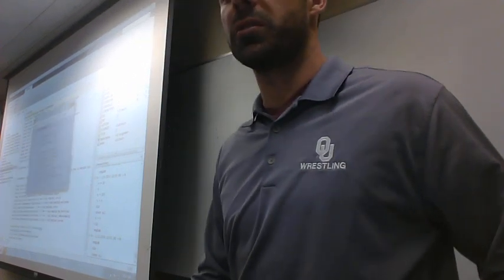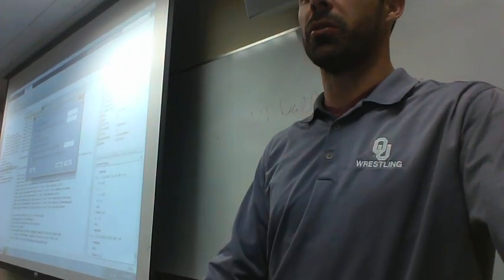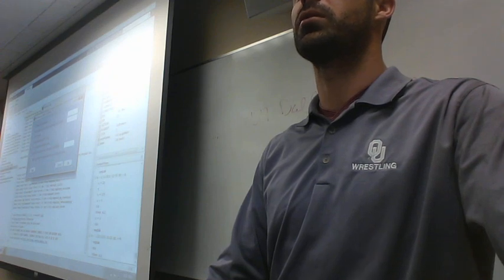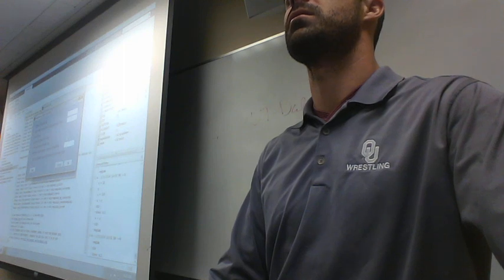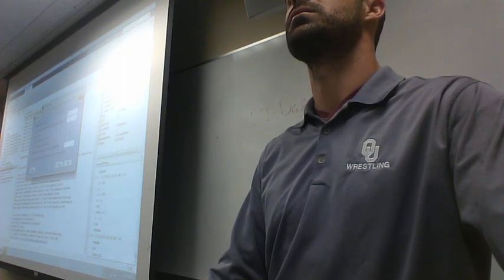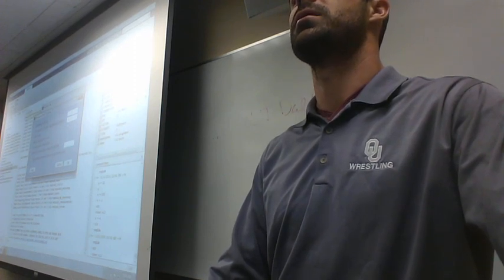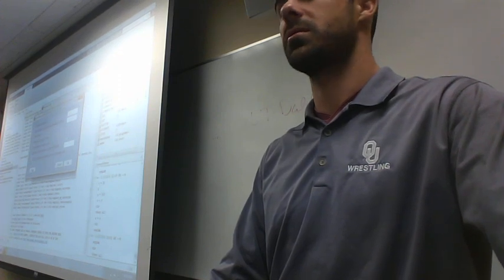It's going to start doing things for a long time. Well, it will in a minute. So what we're going to do is, yes ma'am. Which one? The only one that ends in the letters BDF. It's just 3.BDF. Are you good? Yes, of course.